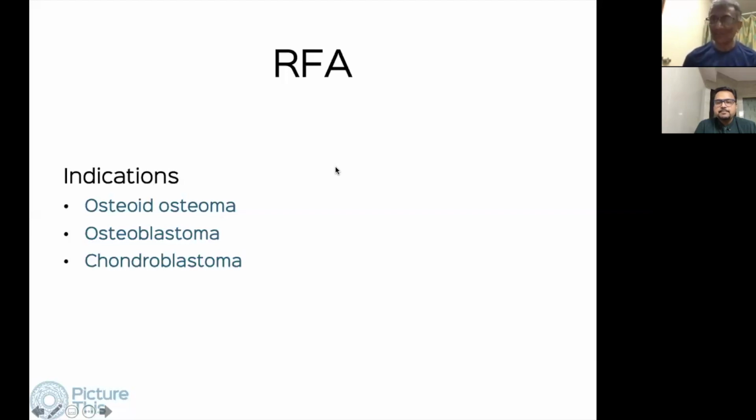And in case you're worried, we can inject distilled water along the path or inject air along the path, and both of them are very good insulators. The other needle supplied by Boston, in fact, does not produce heating along the needle. It only produces heating within the bone in the osteoid osteoma. And therefore, unless your osteoid osteoma is in a situation where you have a neurovascular bundle within 0.5 centimeter, there is no problem. So the challenge obviously is in the spine.